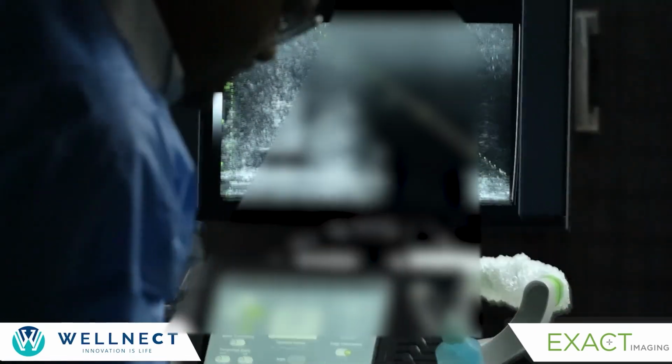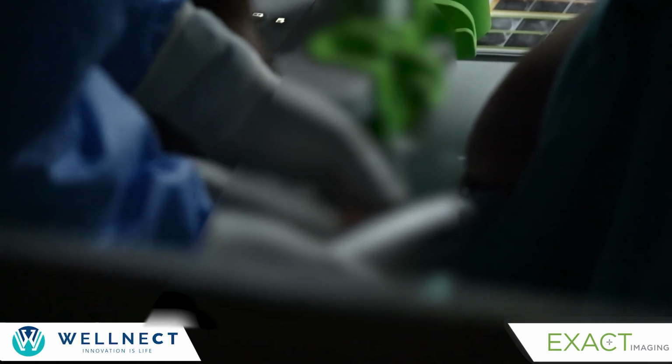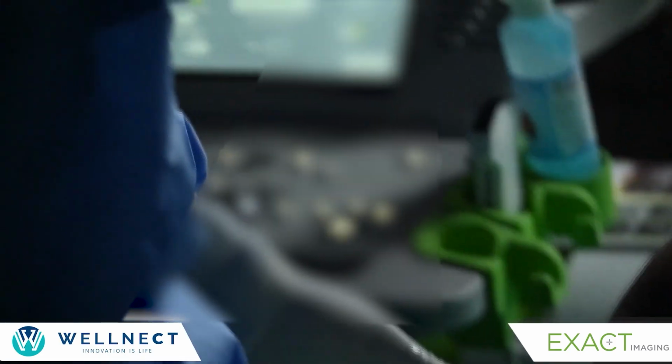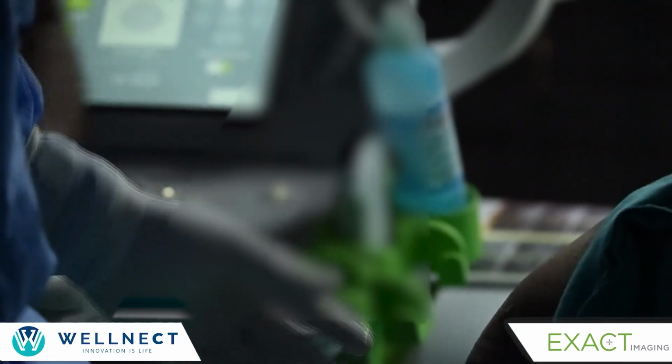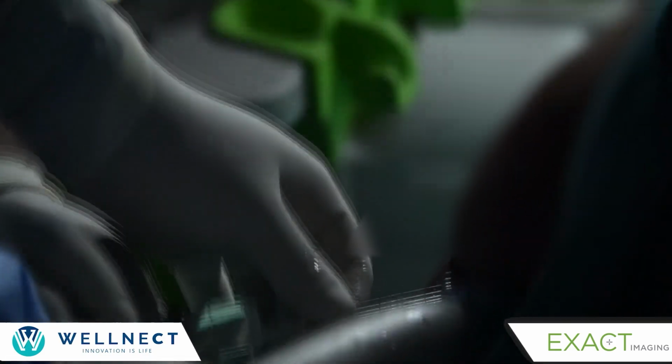So this is where I have got. Okay, now can somebody come and help you? You just remove this. And you're still fasting. Sorry, the liquid. Yeah, half of it here. So this is the right side. You have to inject it on both sides.